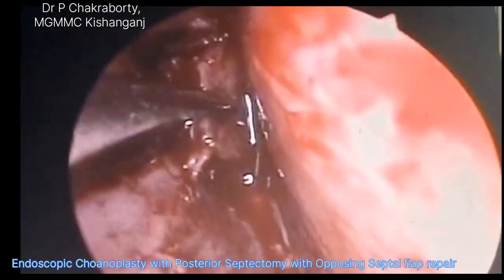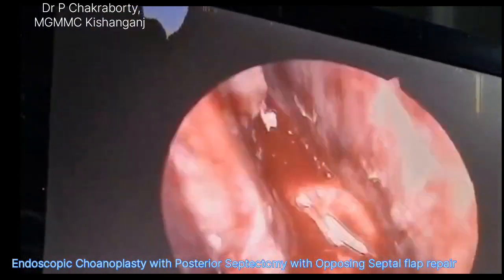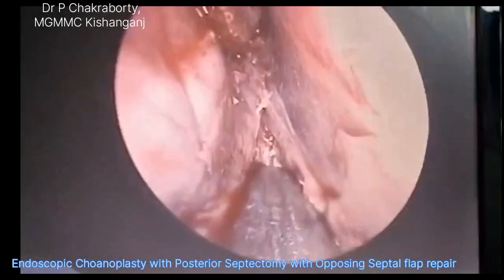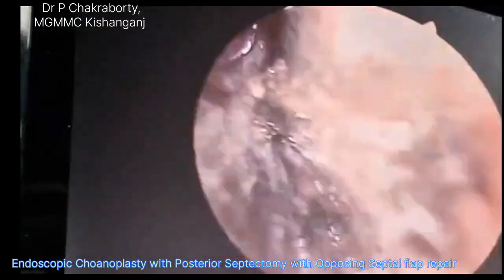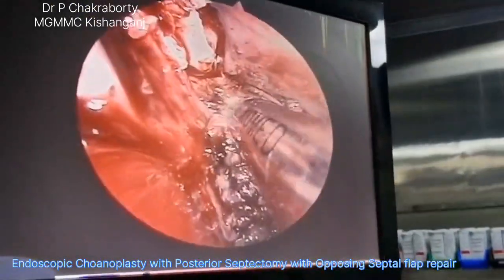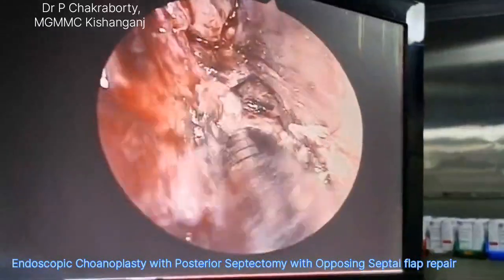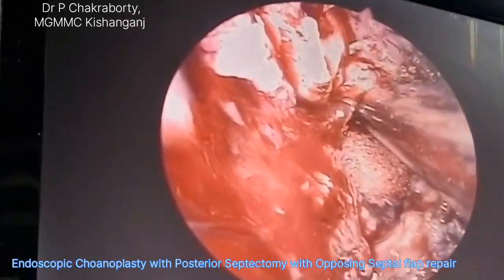So now in this section you can see we have raised the flap on both sides, and now we are seeing the posterior end of the septum being removed, that is the posterior septectomy is being done. We have taken small bits of videos from the surgery, and here we have removed the posterior end of the septum, and you can see the atretic plate being cauterized, and after the cautery has been done, we are using a micro debrider to take out the atretic segment, that is the posterior end of the choanal atresia.